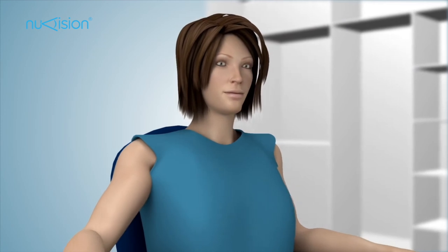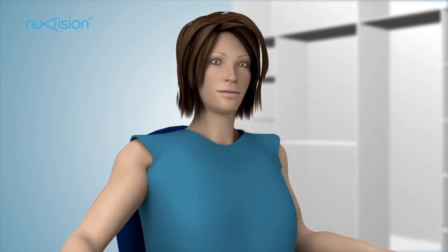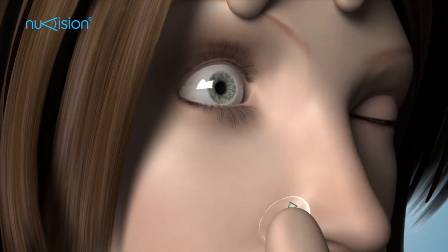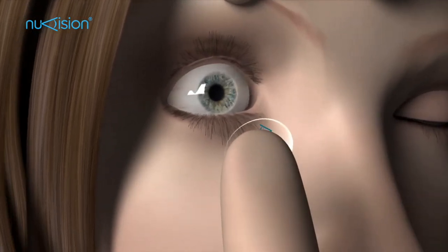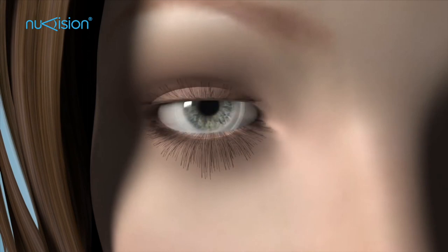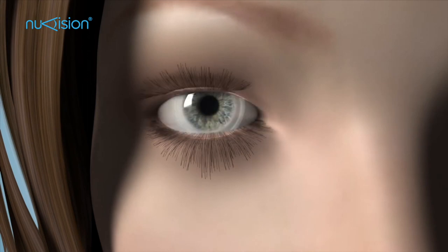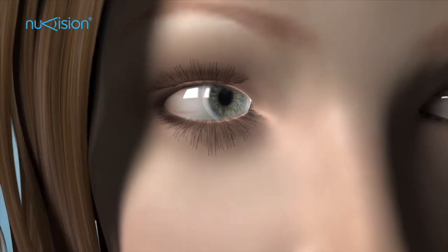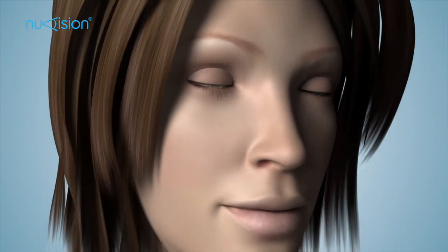Now apply the OmniLens. With the patient seated upright, place the OmniLens onto the ocular surface as you would any bandage contact lens. Once in place, ask the patient to gently blink to centre the lens. If air bubbles are present, gently rub the closed eyelid of the patient to manipulate the lens and remove any air bubbles.